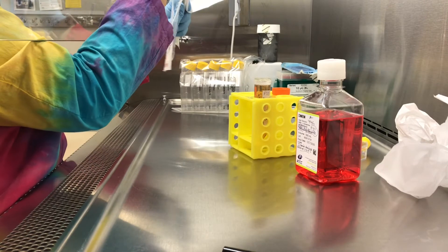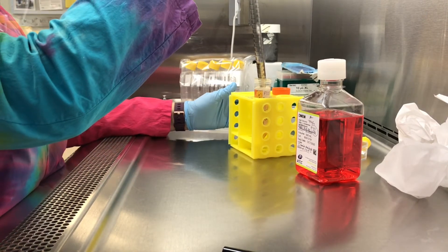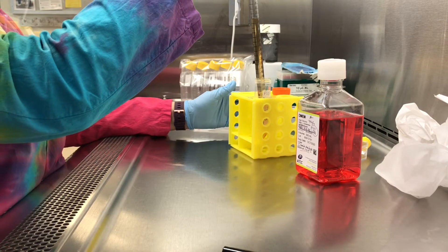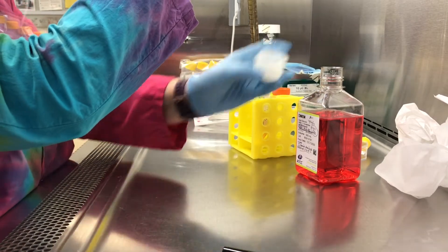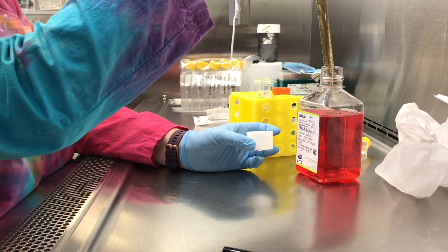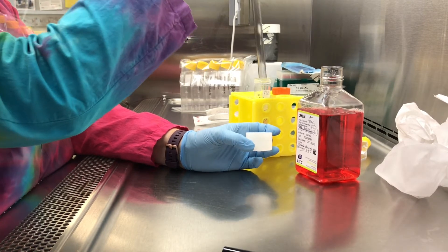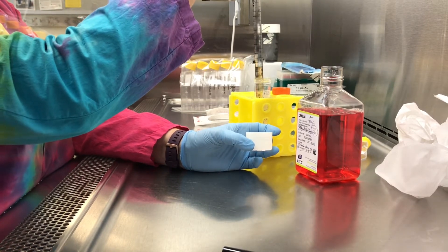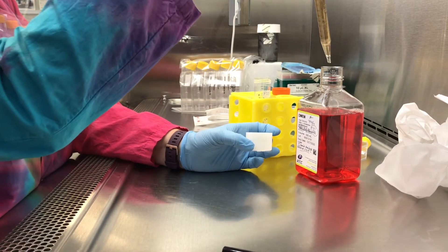I've opened the cap and the lid on the bottle of media is already open. Now I'm pulling up into the pipette — I have a 25 mL pipette, so I'll need to do this a couple of times. The total volume of the media is a 500 mL bottle and I'm adding 50 mL of fetal bovine serum, so it's about 9.3% — but we just round it up to ten.